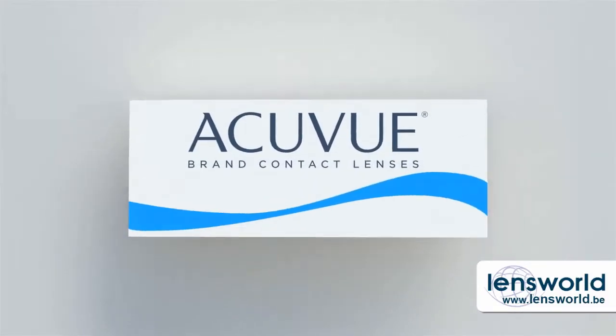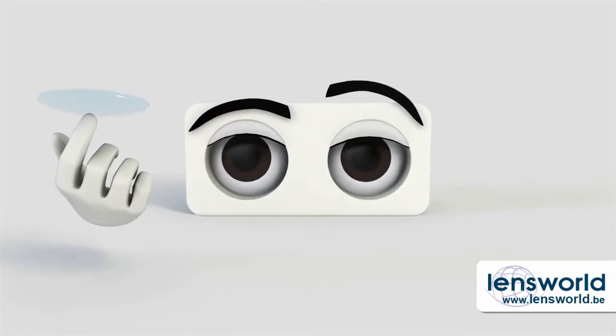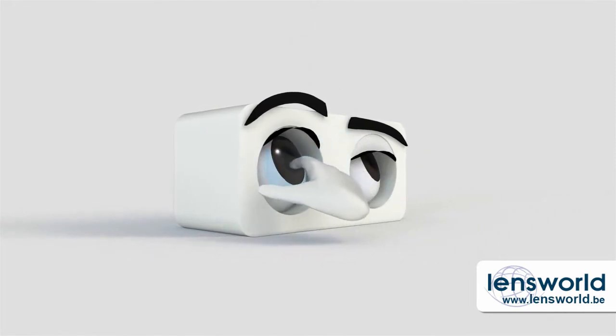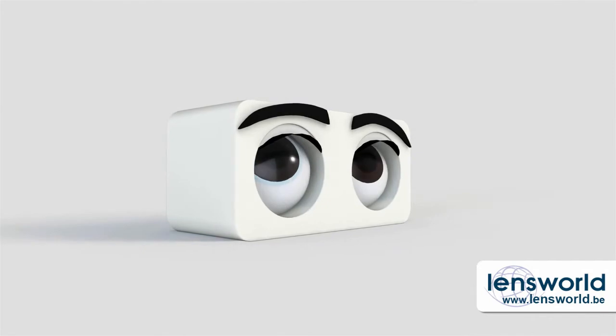You've just gotten contact lenses. Nervous about putting them on? Don't be. You'll be amazed how quickly it becomes second nature. Here's a tip: don't think of it as putting a contact lens in your eye — you're putting it on your eye. You barely touch your eye at all, because the soft lens glides into place as soon as it reaches the surface.